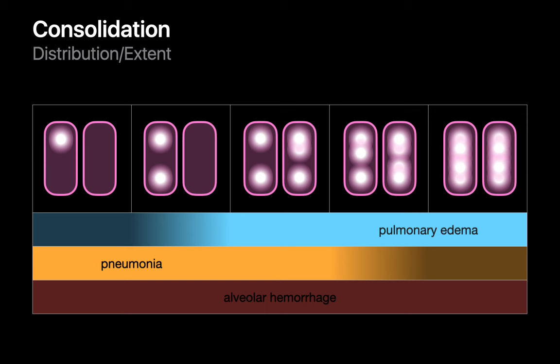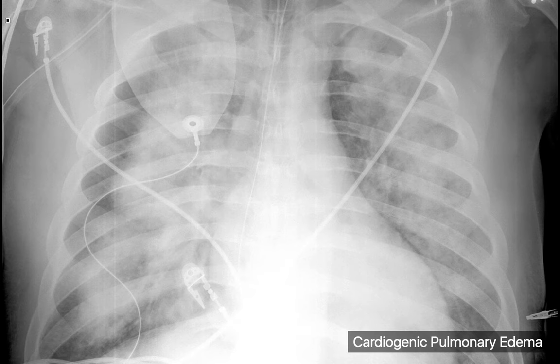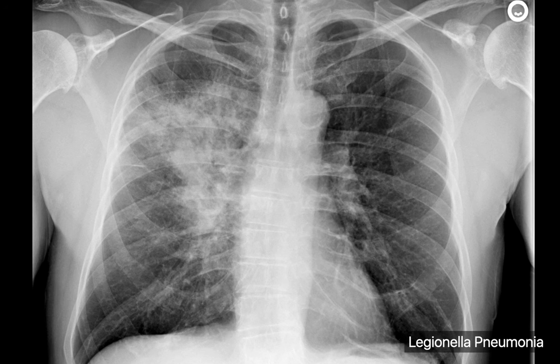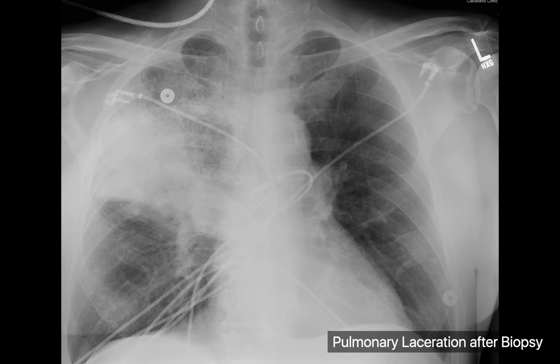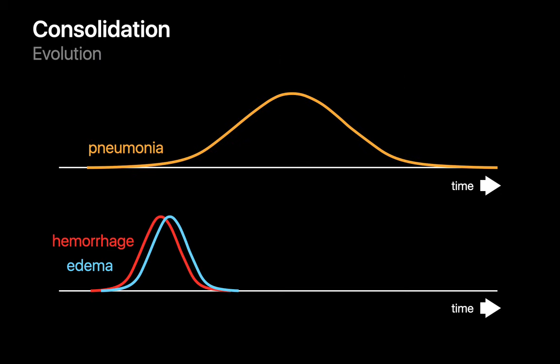Here are classic examples of consolidation in the setting of cardiogenic pulmonary edema, pneumonia, and alveolar hemorrhage. The evolution over successive chest x-rays also provides a hint: with pneumonia, consolidation usually progresses over days and resolves gradually. With pulmonary edema and alveolar hemorrhage, consolidation may appear quickly, sometimes over just a couple of hours, and when treated resolves relatively quickly too.